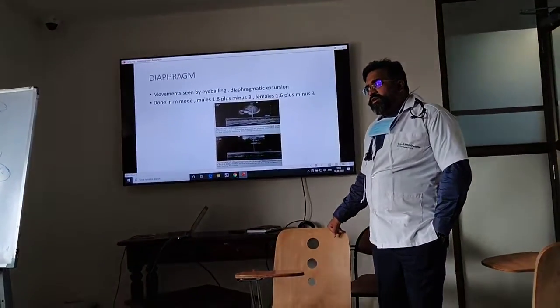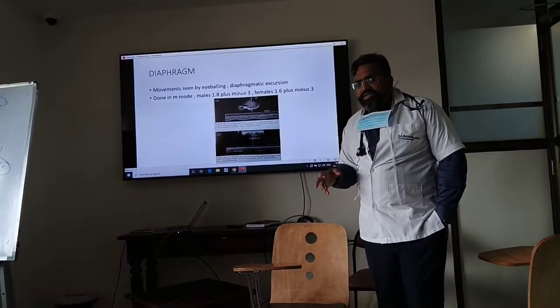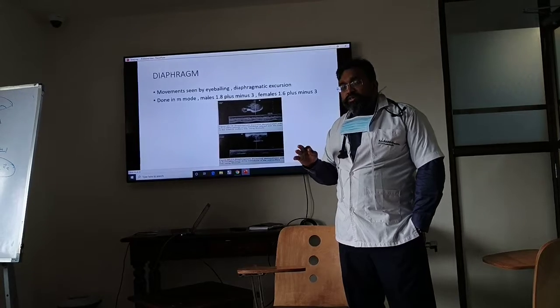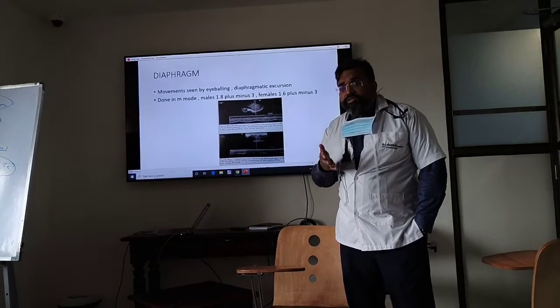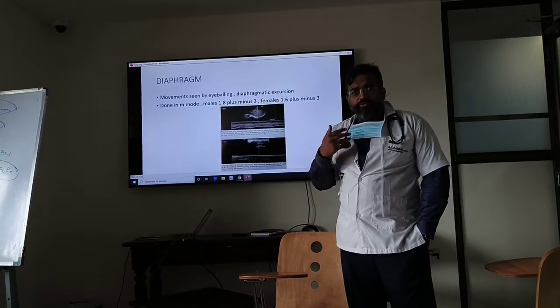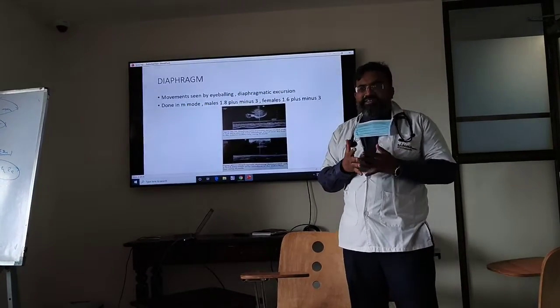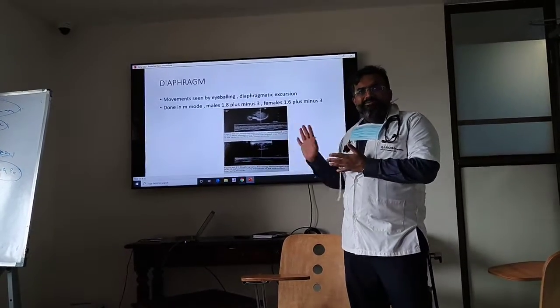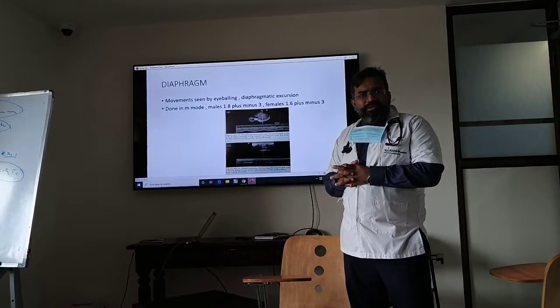You understand? So see, all these things look very good when you read. You have to practice it out. Then you'll notice you'll start getting interested. Arey, wow, I saw this. You have to get to understand to use it in practice. You have to be interested to do it. If you are interested to do it, you will never forget it in your life. You understand? You will never forget it.